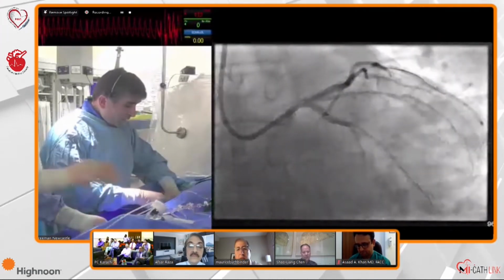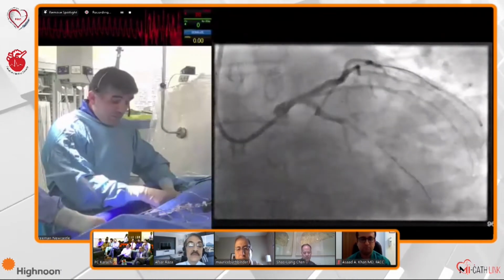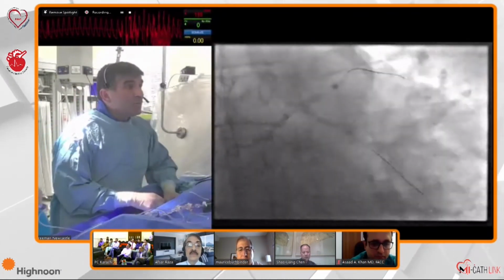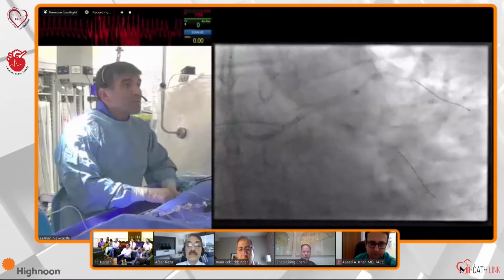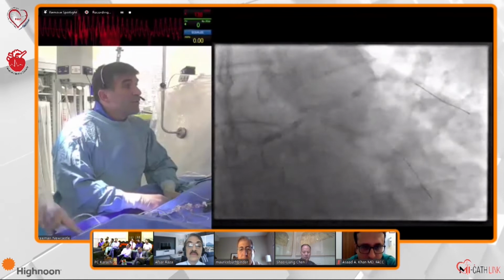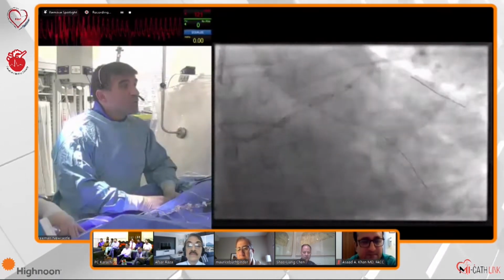And one of the advantages to my mind now with IVL, and I know it's off-label, but it won't be long before everybody's doing it. We feel a little bit more reassured, or maybe falsely reassured, I don't know, that if you put in a stent that's not expanded, you could use the IVL in it. Nobody knows what happens to the polymer, to the drug, but a lot of people are doing it, and it's not causing any major problem.